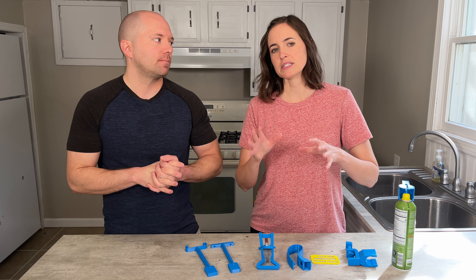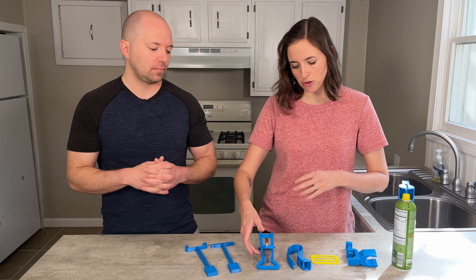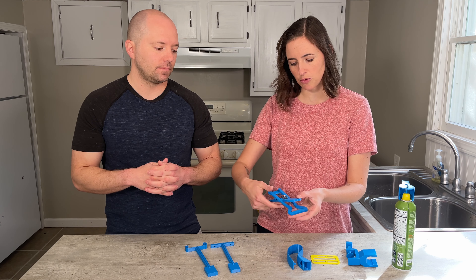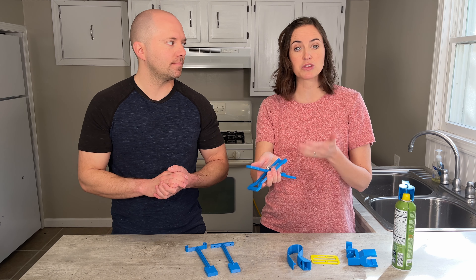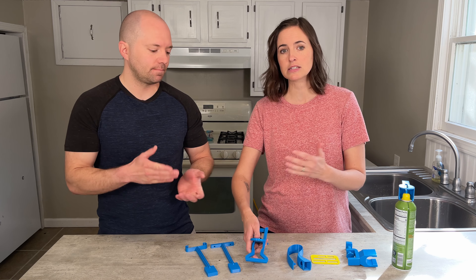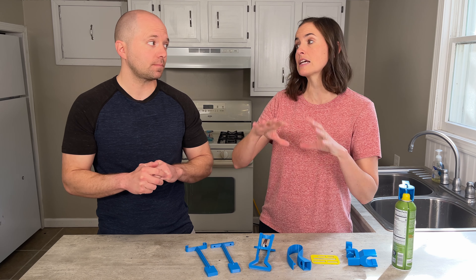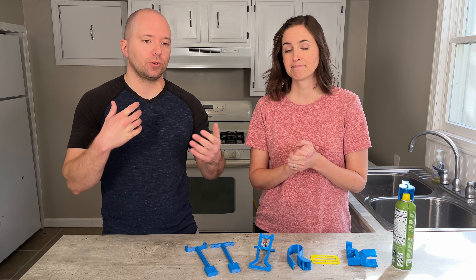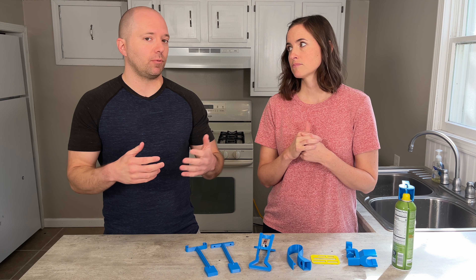There's also another website called Google — you can enter what you're looking for plus '3D model' into Google and it will potentially find something you may be looking for. If you're looking at adaptive equipment specifically, it's great to search by what function you'd like it to serve. For example, this is for one-handed nail trimming — it's called Flipper the Clipper. By searching 'one-handed fingernail trimmer' you're able to come up with designs like this. Searching by function is a good way to find products that have already been designed.